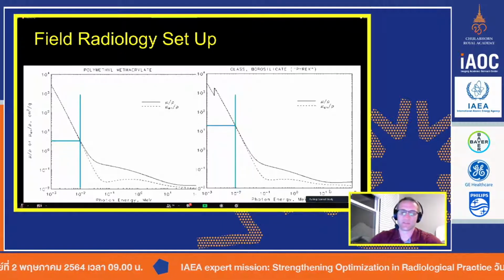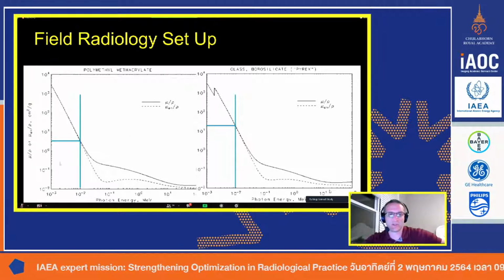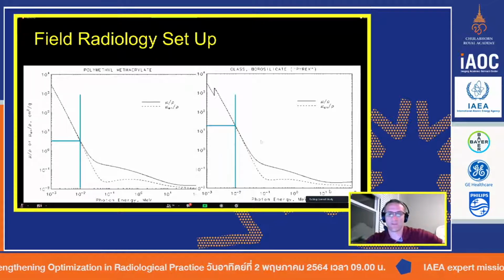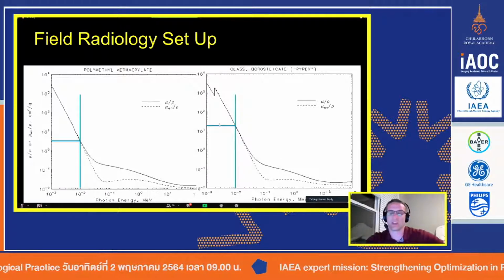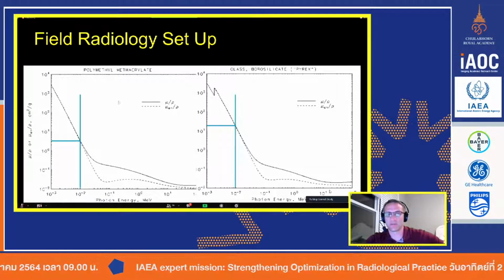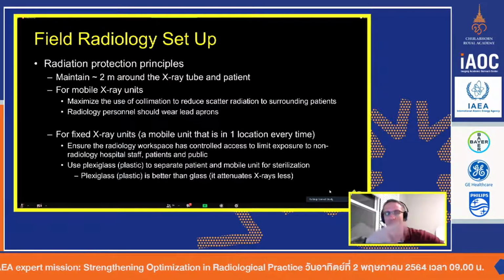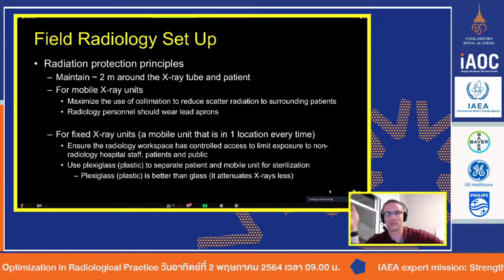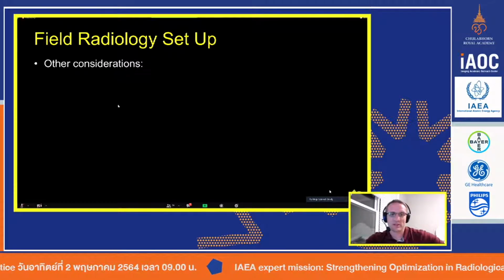Oh, there they are. I'm sorry, my slides are out of order. I'll go back to that last slide. Plexiglass doesn't have as high an attenuation profile as glass. So for the same kV, or for the same amount of photons to the detector, you can use a lower kV, or you could use a lower kV and a lower mA. So imaging through plastic, you won't necessarily need to dial it all the way up to 130 kV. You might only have to go up to 110, maybe 120, but your mAs might not have to go up to 12. It could be maybe 8 or 6. So sorry, my slides are a little out of order there.